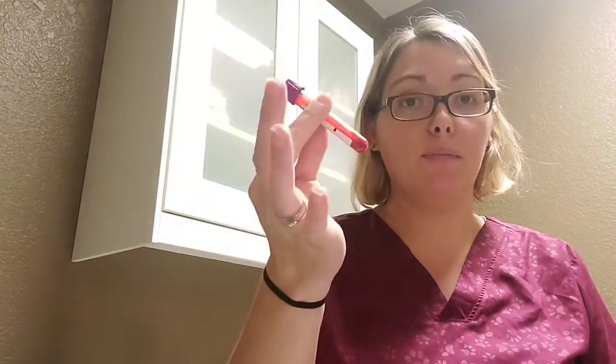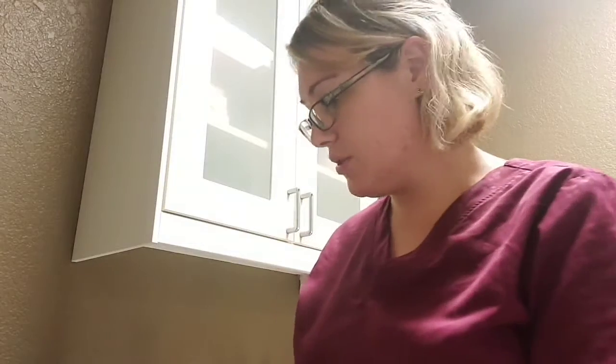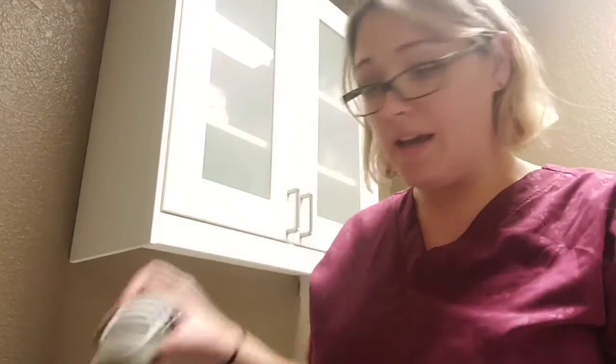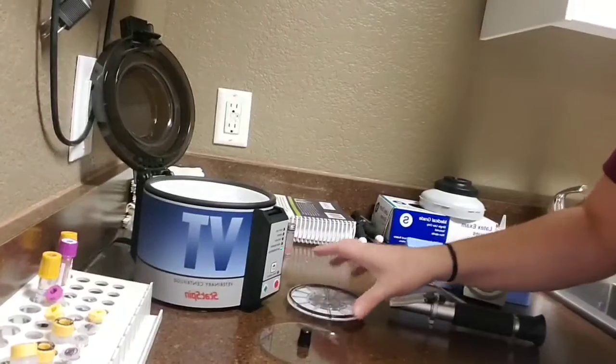So just real quick, some of what we're going to need material-wise is a sample of EDTA blood here, as well as a couple of microhematocrit tubes, if you can see those, the clay for those, a refractometer, and a couple of syringes. I just find it easier to get the plasma out of the microhematocrit tubes with a little bit of help since they're so small. A timer, which I have here, as well as a calculator for calculating our totals at the end, and our stat spin with our attachment for spinning down those microhematocrit tubes.